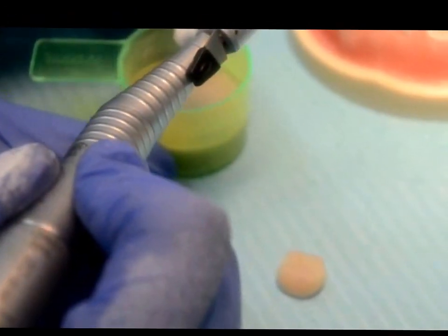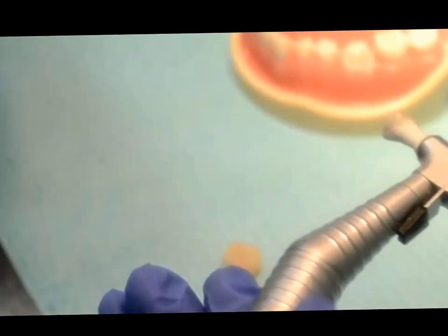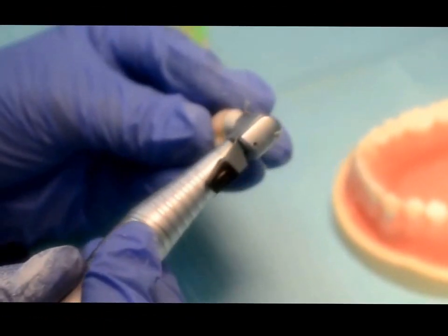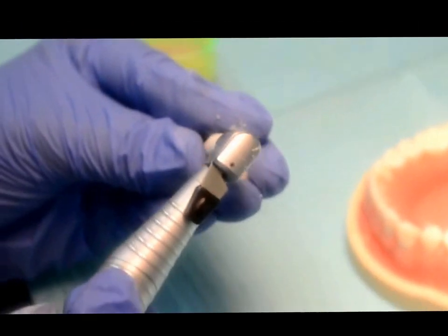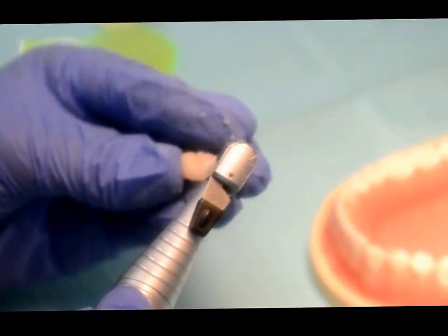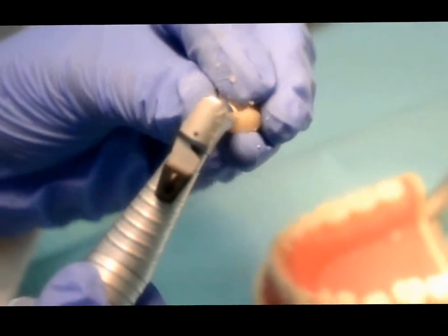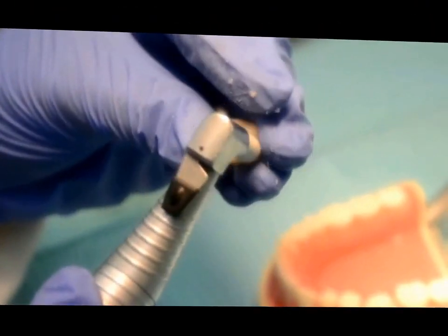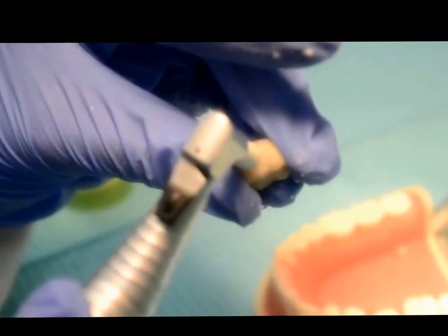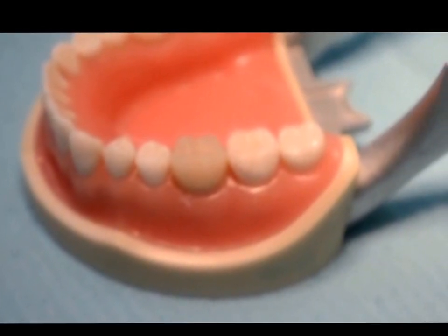You have to do the polishing by using pumice. We do the polishing step to prevent accumulation of plaque.